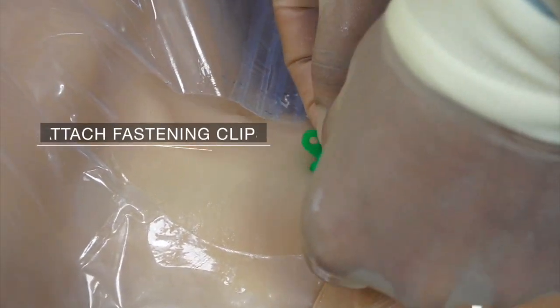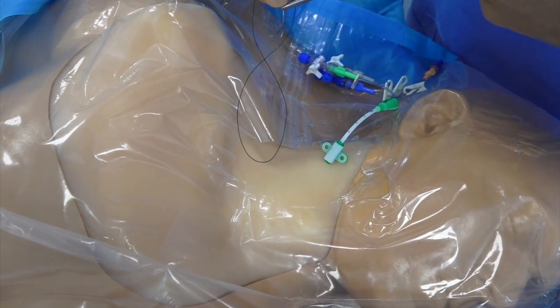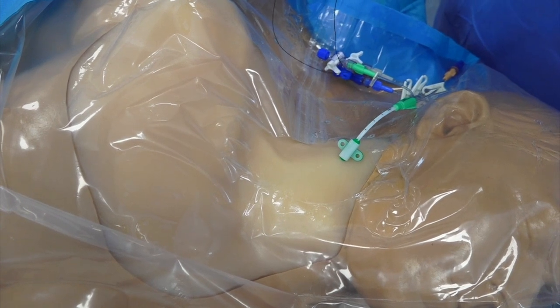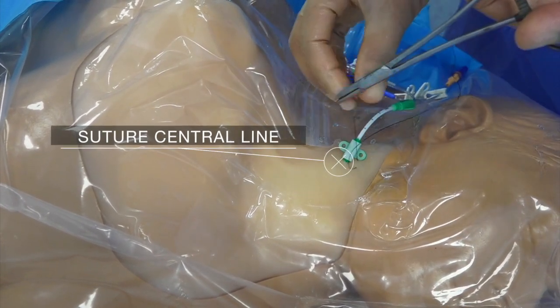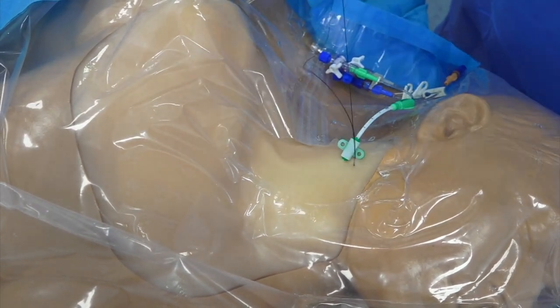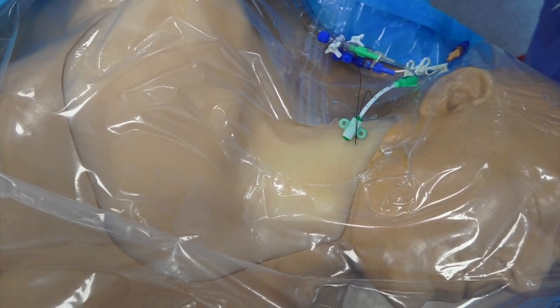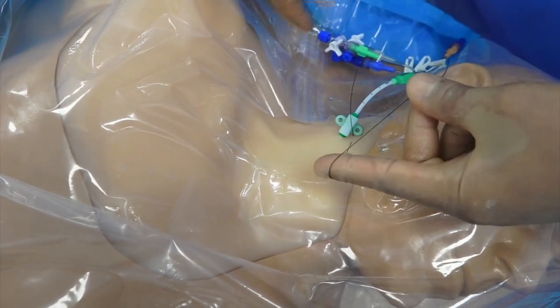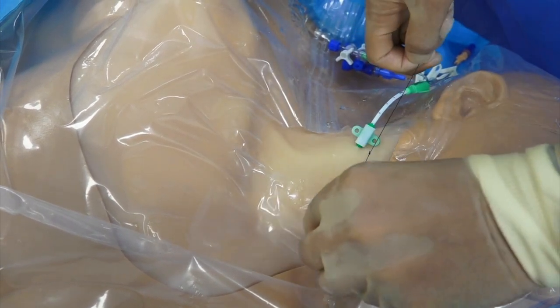Attach the sterile clips included with the central venous catheter at the appropriate point where the catheter meets the skin. Suture in the central venous catheter at at least two points — at the clip site and at the hub. Loose knots are tied at the skin and tight knots are tied at the clip or hub.